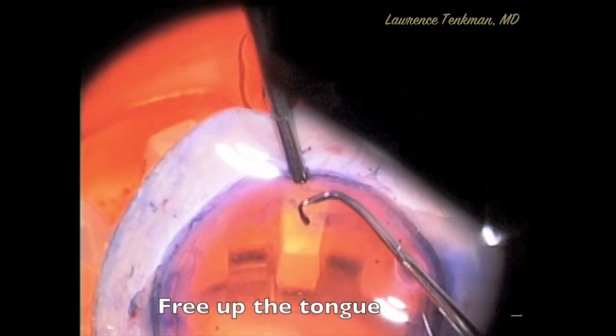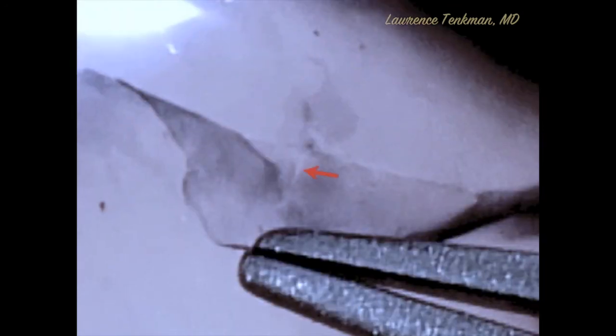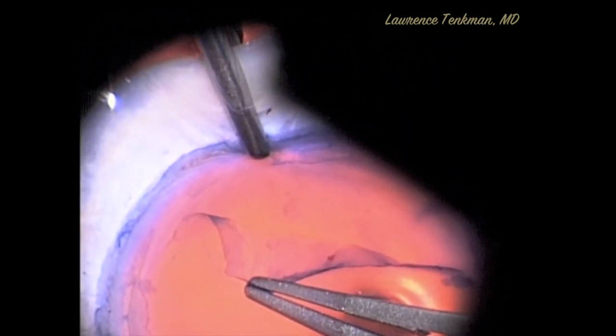Here's a case where I found a full thickness tear, freed up its tongue, then when I put a drop of TriPan, it became clear that there was a small area of full thickness tear but a much larger area of anterior lamellar splitting. In fact, during the free-up, I severed part of this anterior lamella. Pulling from exactly in front of the horseshoe tear, the peeling can be safely completed.